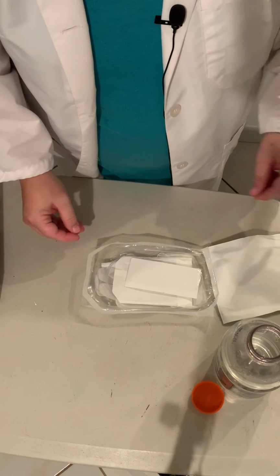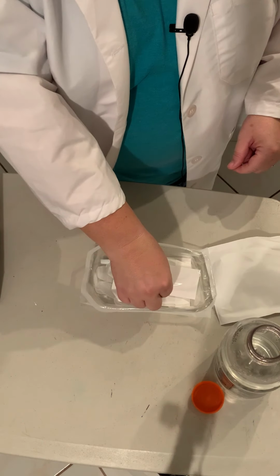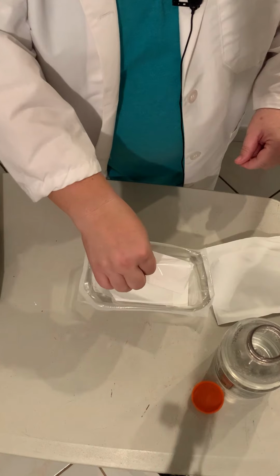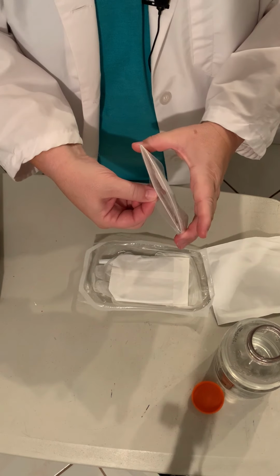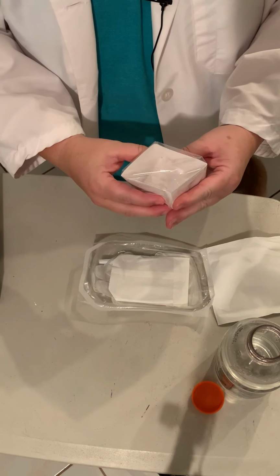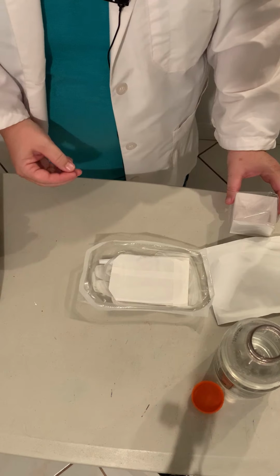So next we're going to grab the box out of there. And I always grab it by this plastic because I don't want to risk touching anything else in there. Okay, you want to make sure you don't touch this top plastic edge because that needs to stay sterile. So then we're going to squeeze the box so it opens up. And we're going to set that on our table here.